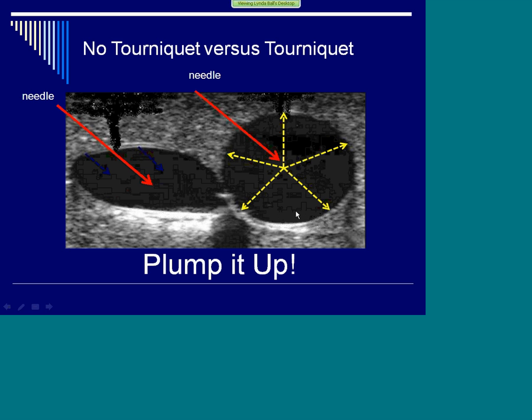And by definition, we want to be in the center of the blood vessel, and that will prevent us from damaging the lining. It will decrease the number of alarms that we have because of our cannulation technique. And so our patients should be able to get better flow rates as a result of that as well.